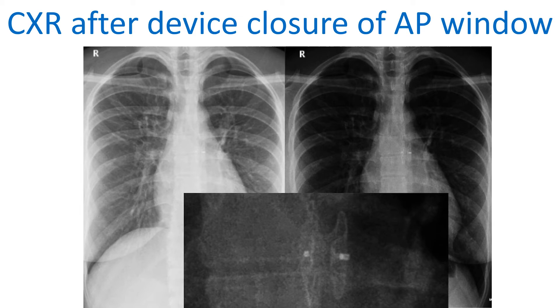With the availability of post-processing on digital X-rays, it is easy to make the device appear more prominent, as we have done here. The device will be much better seen on cine X-ray fluoroscopy.